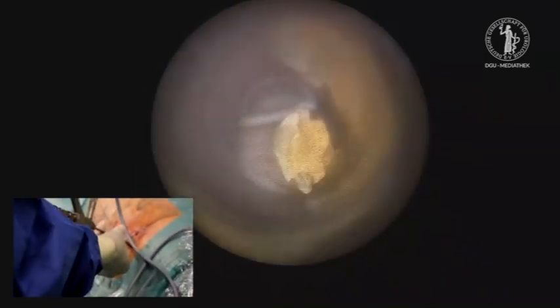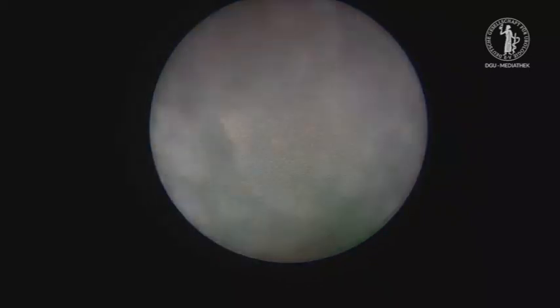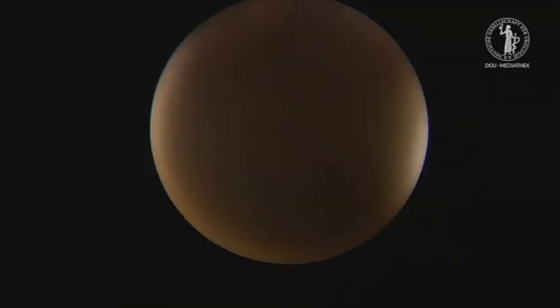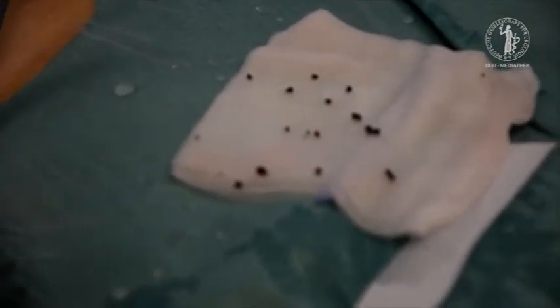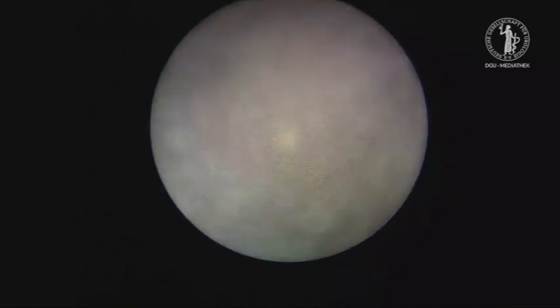All stones that are accessible with a rigid scope are disintegrated and flushed out. Again, it can nicely be seen how effective laser lithotripsy works without annoying retropulsion.